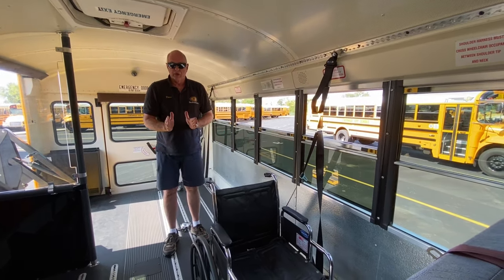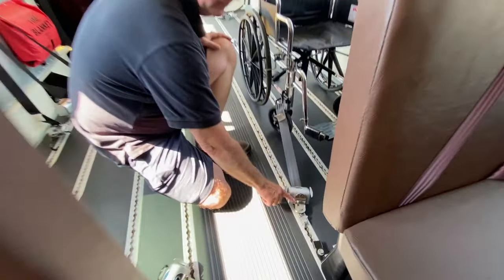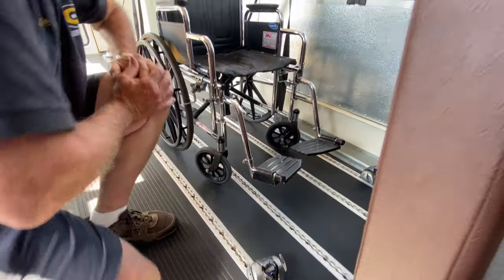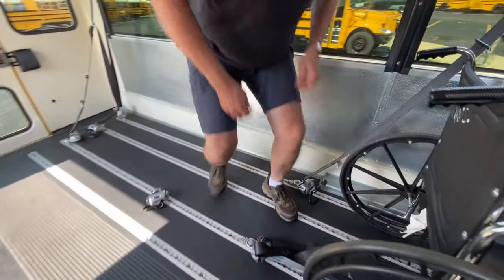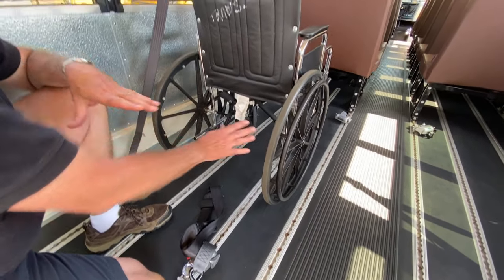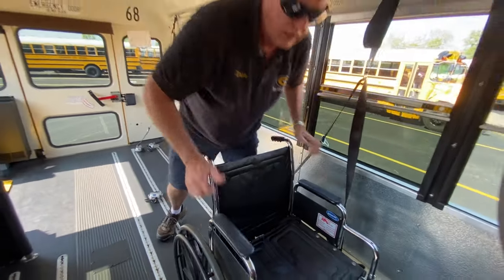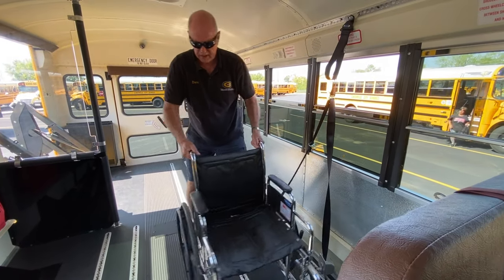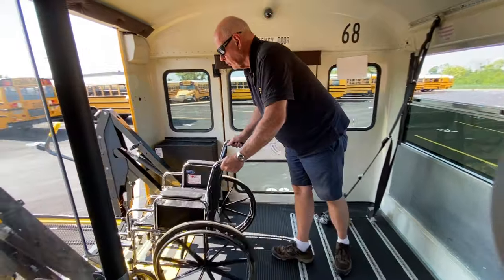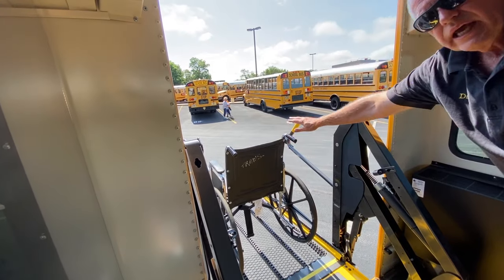Now we're going to reverse the process — say we're at mom's house or at school to let them off. We'll push down the lever to release the belt and unhook it. Be aware that sometimes these chairs might have a sharp edge, so make sure the belt isn't dragging across a sharp edge. We're going to release and unlock the chair, scoot it over, bring it out, and place the chair on the lift. Whoever is going to receive it — the driver or the aid — and we're going to lower it down.